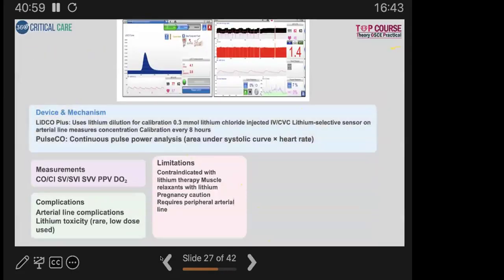And know about the values which come out of the cardiac output monitor, like EVLW, PVPI. How could you differentiate between hydrostatic and ARDS? All those could be the common questions when it comes to OSCE with cardiac output monitoring devices.